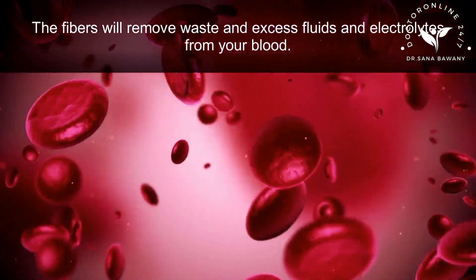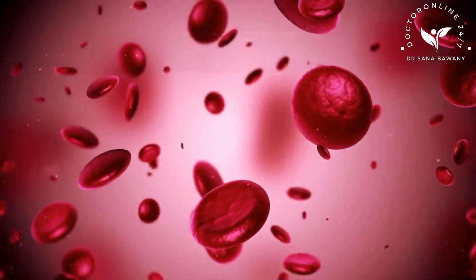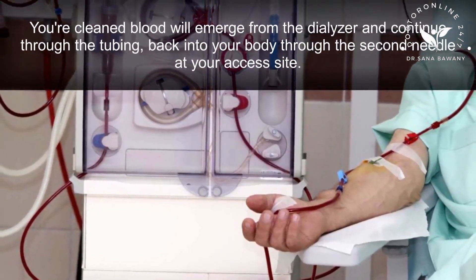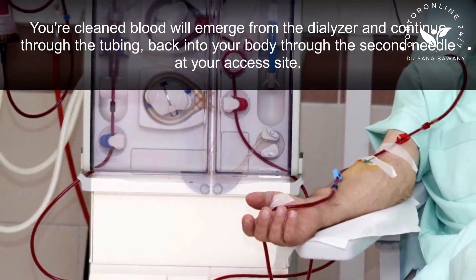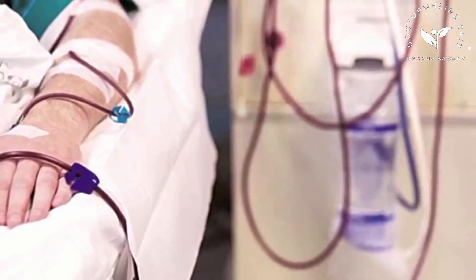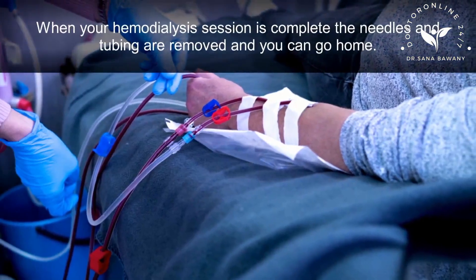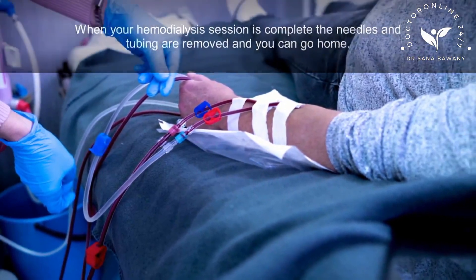Inside the dialyzer, your blood will encounter filtering fibers and an absorbent cleaning solution called dialysate. The fibers will remove waste, excess fluids, and electrolytes from your blood. Your cleaned blood will emerge from the dialyzer and continue through the tubing back into your body through the second needle at your access site. When your hemodialysis session is complete, the needles and tubing are removed and you can go home.